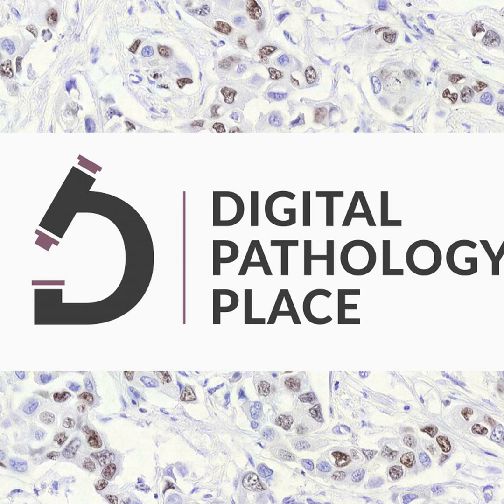We are not talking about anything three-dimensional, or really something that is dynamically zoomable. This is a flat image of a glass histology slide used for routine assessment in generation of the pathology report.